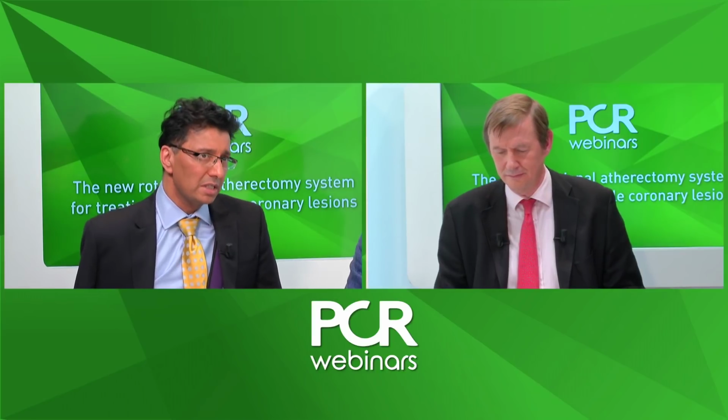There have been some bench studies, by Mark Reisman, that show slower burr speeds are associated with less platelet aggregation. So that's one argument for slower burr speeds. Another is that there have been at least 2 registries which have shown categorically that there is less restenosis with slower burr speeds, and by that I mean 140 to 160,000 revolutions per minute compared to 180 plus, achieving the same lesion success.